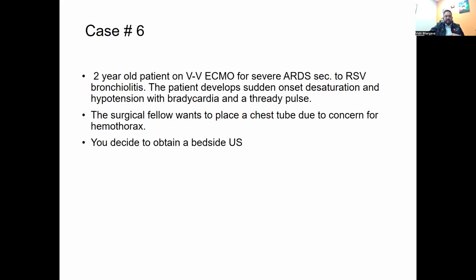The last case that I have for lung ultrasound is this one. You have a 2-year-old patient on VV ECMO for severe ARDS secondary to RSV bronchiolitis. The patient develops sudden onset desaturation and hypotension with bradycardia and a thready pulse.